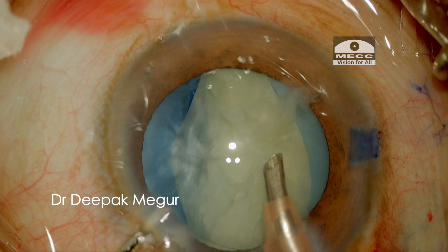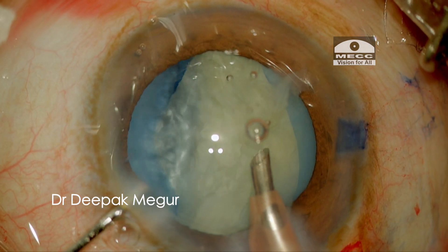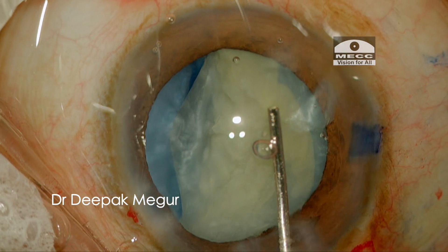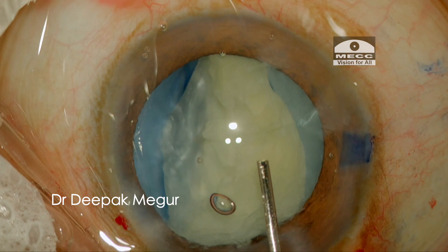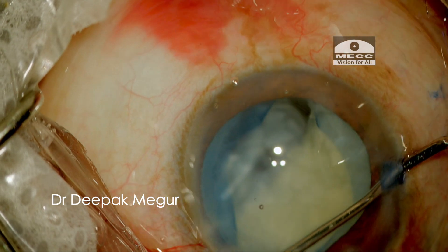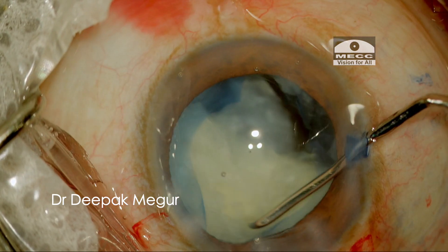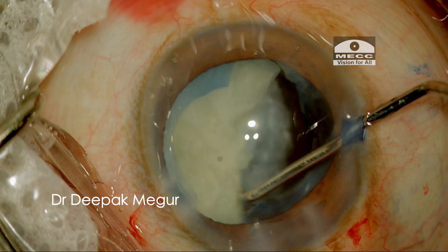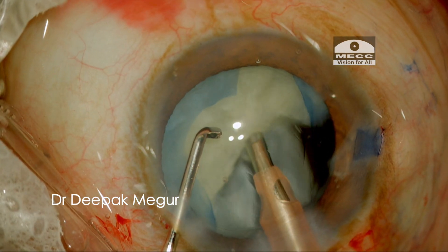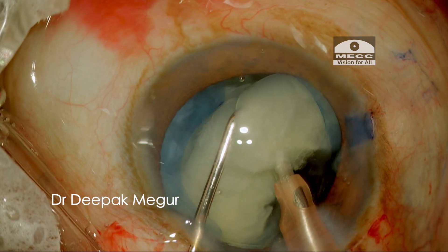Before coming out of the eye, I inject OVD through my non-dominant hand to ensure that the chamber does not shallow. After the first hemi-nucleus is removed, there is enough room now in the bag, and hence I can afford to gently maneuver the nucleus around, but only after I fill the bag with OVD. I am performing a horizontal chop to divide the second hemi-nucleus, with the fragments then emulsified with ease.